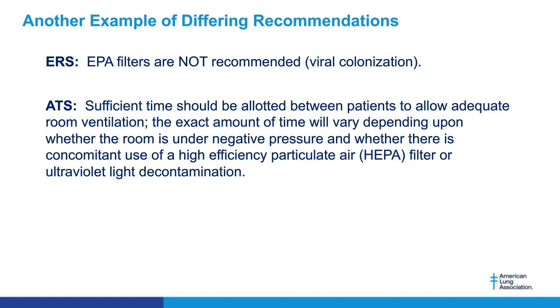The American Thoracic Society says that there should be significant time allowed between patients to allow adequate room ventilation, and the exact amount of time will vary depending on whether the room is under negative pressure and whether there is concomitant use of a high efficiency particle filter or a HEPA filter. Our infection prevention people say it's all about the air exchanges. How fast is the air exchange, regardless whether it's negative flow or if it has a HEPA filter or not.